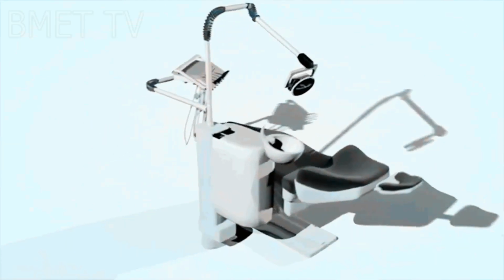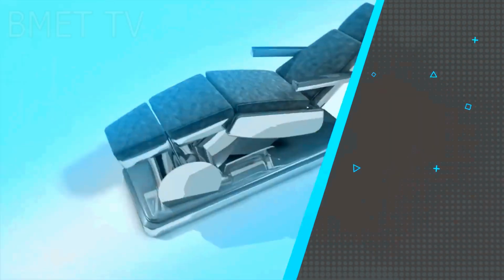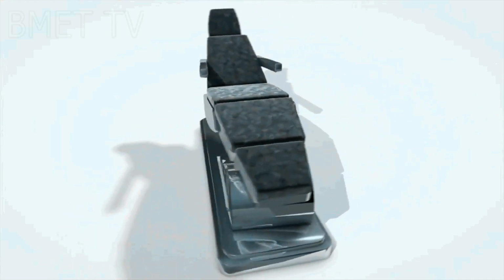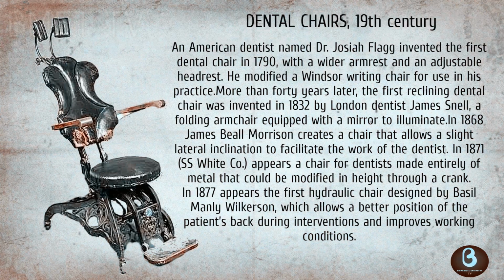Look into dental chairs and their components. So where did it all begin? The history dates back to 1790, where an American dentist named Dr. Josiah Flagg invented the first dental chair. He modified a Windsor writing chair for use in his practice. This was a plain wooden chair with a padded headrest with a tray for equipment on the side.